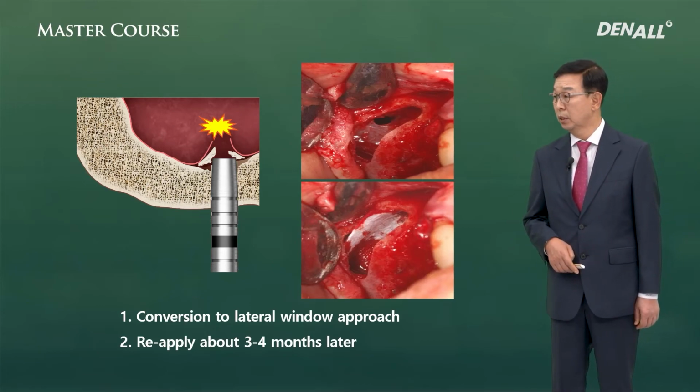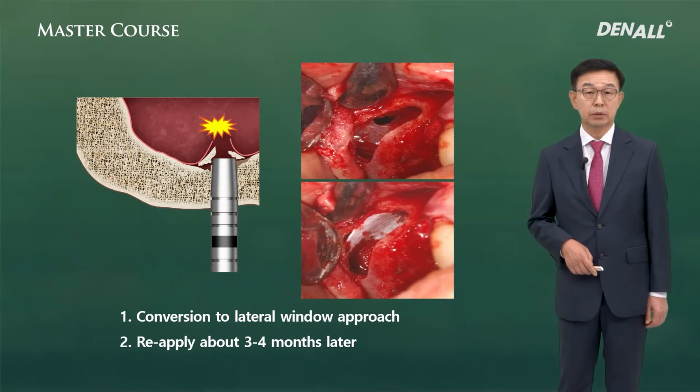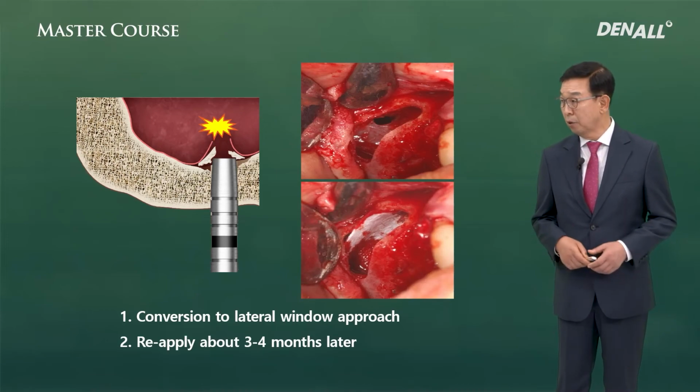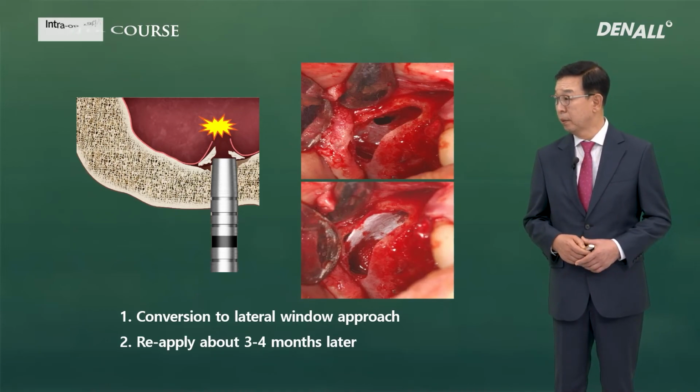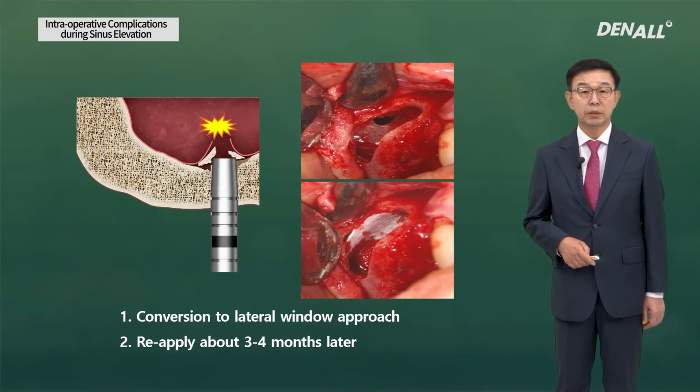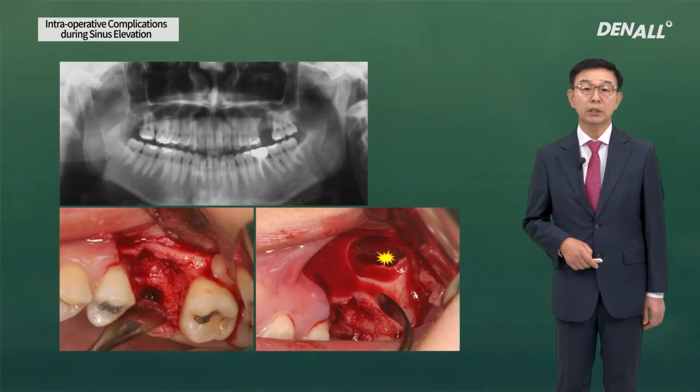Fortunately, with the introduction of CAS kit, there's a very rare case of sinus membrane perforation during crestal approach. The possibilities are really rare.